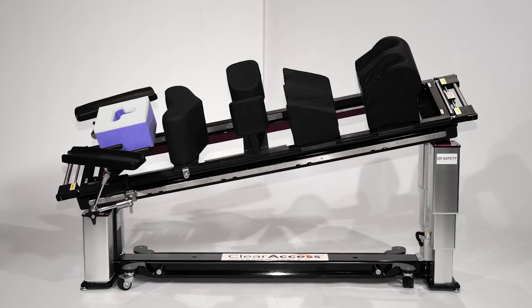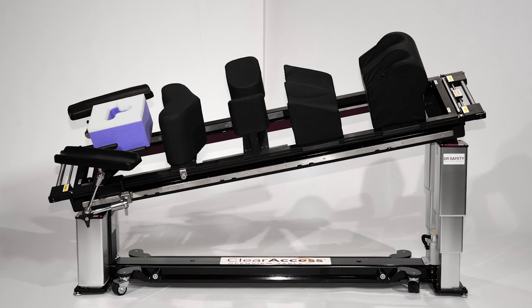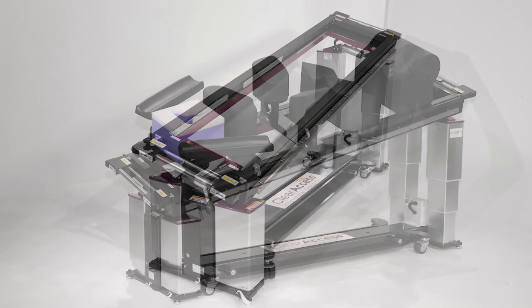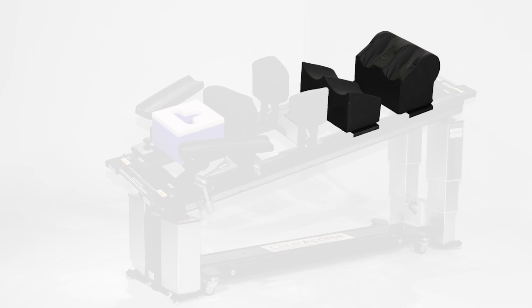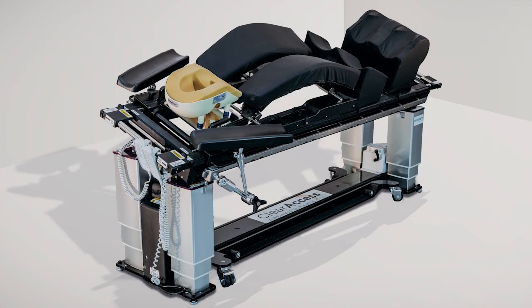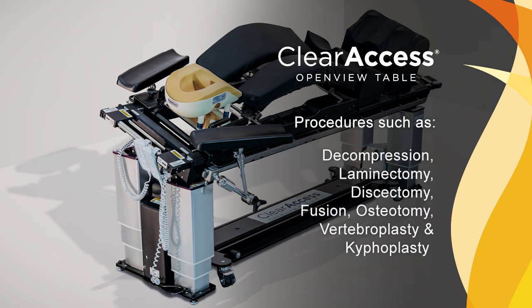This highly versatile specialized surgery table system begins with the Clear Access table base and two tabletops: the supine platform or flat top, and the prone platform or open top. It includes the Clear Access head support, multi-directional arm boards, the open frame spine frame and leg management system. As an alternative to the open frame, the optional Clear Access flex frame can be installed. This setup is typically used for posterior spine surgery procedures such as decompression, laminectomy, discectomy, fusion and osteotomy.